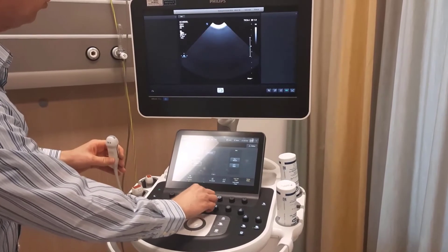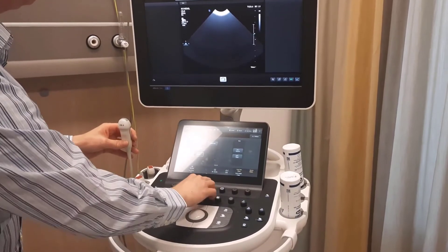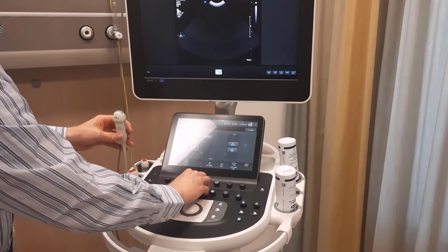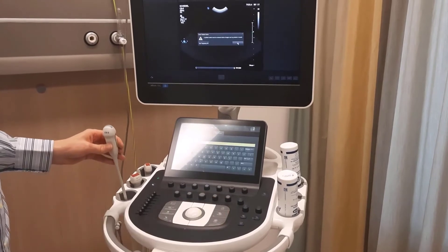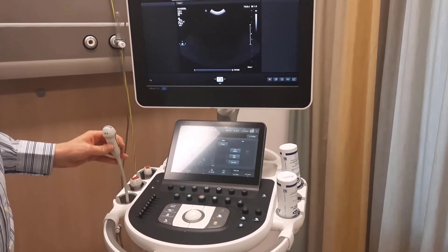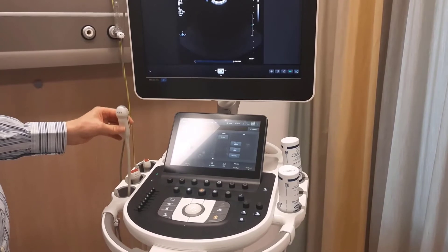If you place this on 100% maximum, you can count the rings. Therefore, we freeze the image and acquire it. This picture we archive in our system for reference.